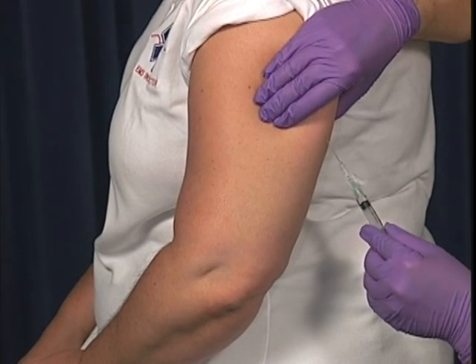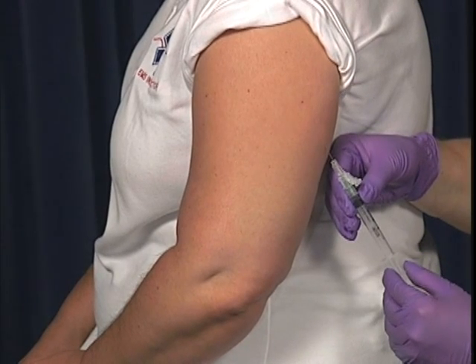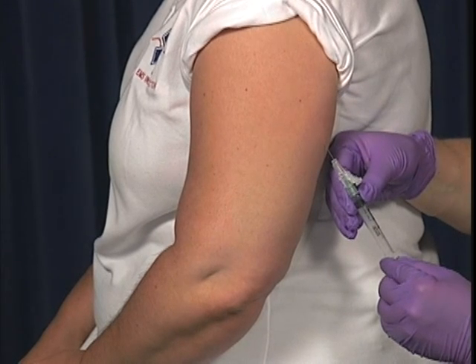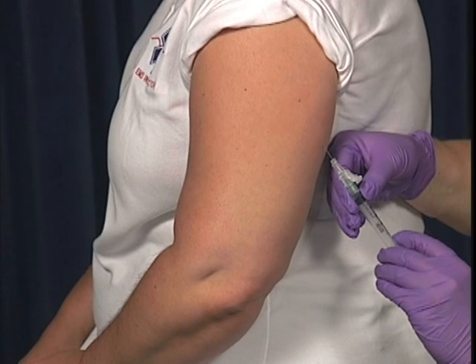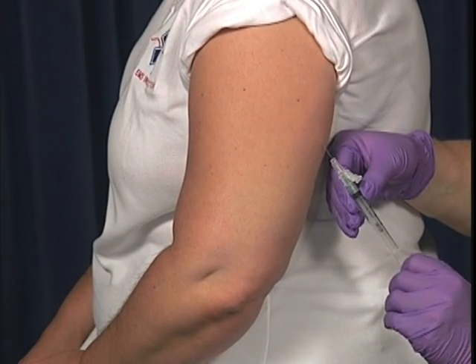Quickly, but not forcefully, insert the needle into the injection site at a 45-degree angle. Release the skin while continuing to hold the syringe in place. Pull back and aspirate slightly on the plunger and wait 5 seconds. If no blood aspirates into the syringe, proceed with the injection.